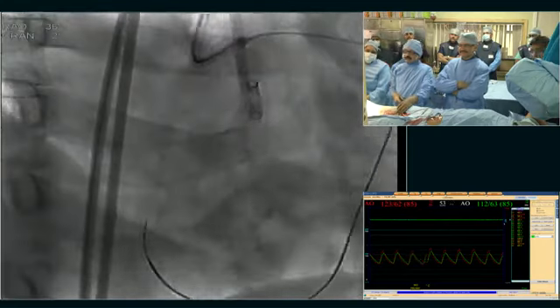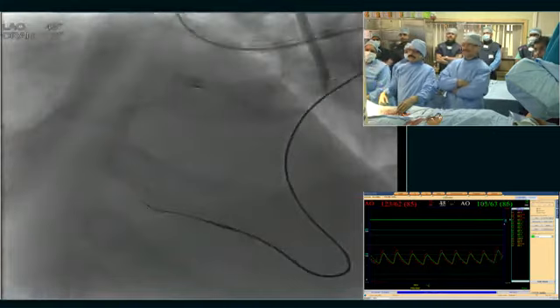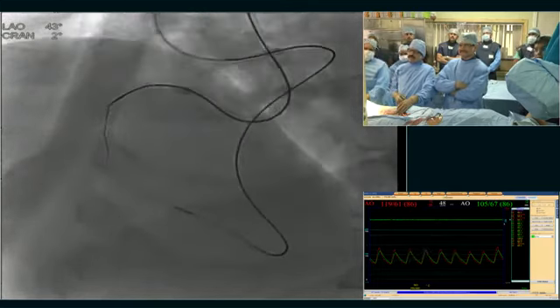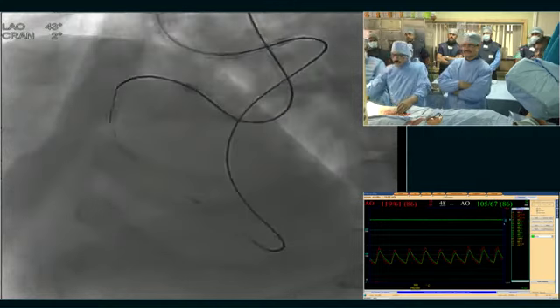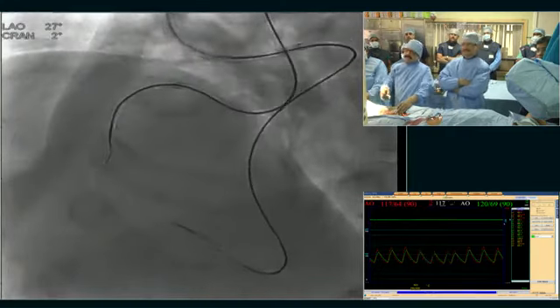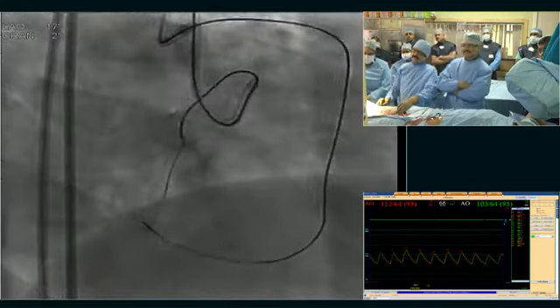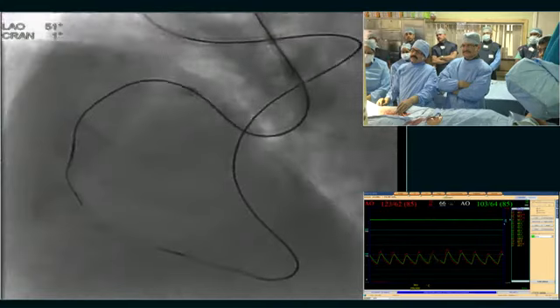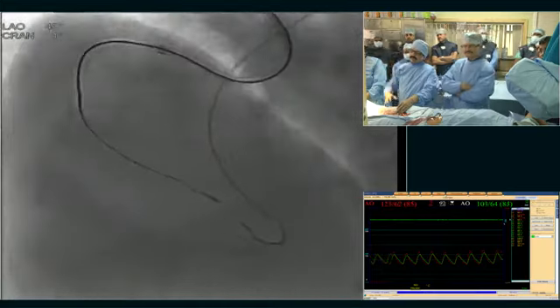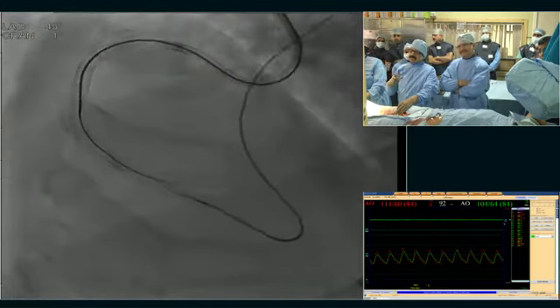Then the antegrade bed preparation was done. We went to a Corsair 135 with a Gaia 1. We wanted to do a reverse CART, but one of the techniques I usually follow, if I feel in-stent restenosis, is a Rendezvous technique, which I tried in this case. But finally, a Gaia 3 could cross antegrade. We tried a Rendezvous technique, but could not succeed. Then finally, a selective retrograde injection with the Corsair.